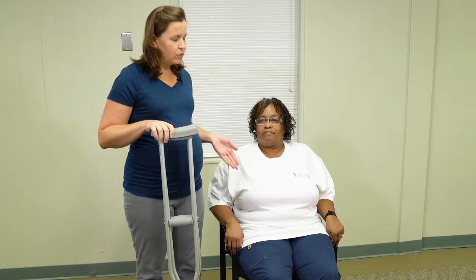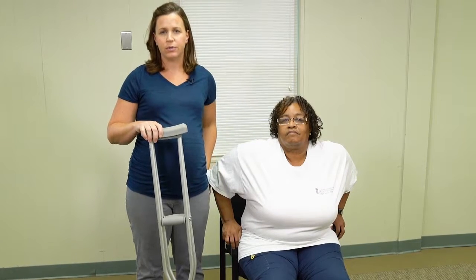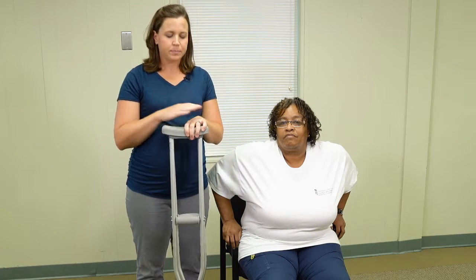We're going to teach you how to come up to sitting and standing properly. If you're in the chair or sitting on a bed, I want you to scoot towards the edge. If you have an armrest on the chair, you can use that to assist you up. I highly recommend, if you're a taller patient, to always sit in a chair with an armrest.